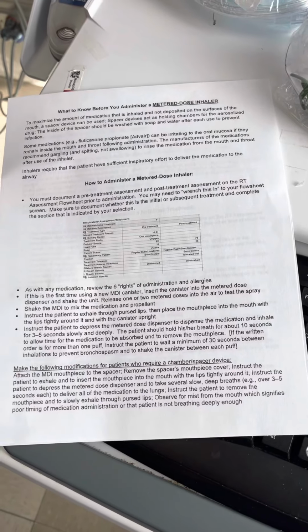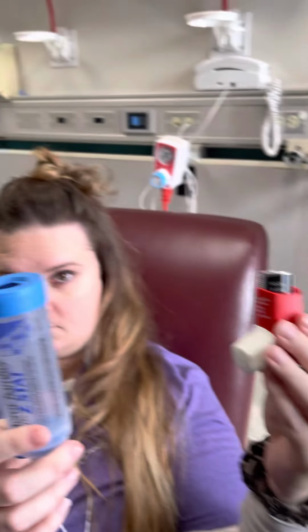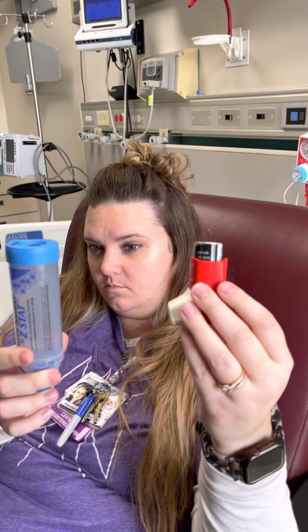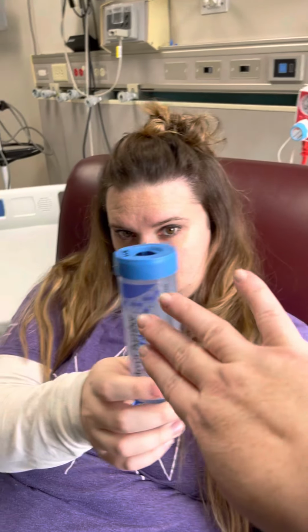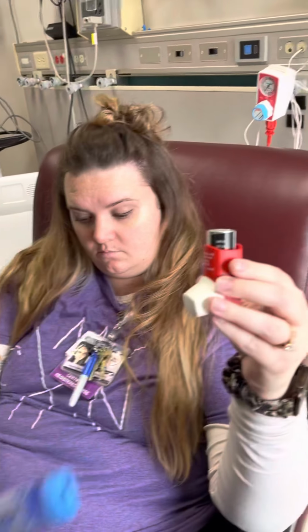There are a couple of ways that the medication can be administered. You can either take it directly from the inhaler, which will look like this, or you can use a spacer. The spacer is typically going to be used for patients who have a hard time forming a really good seal on here and holding their breath after they inhale. With the spacer, you don't have to hold your breath after you inhale the medication. So we'll start first with just the inhaler.